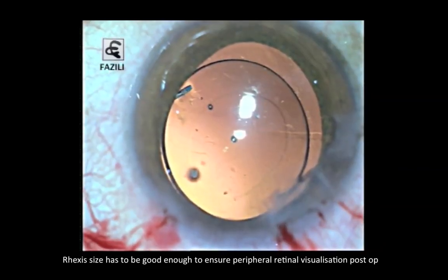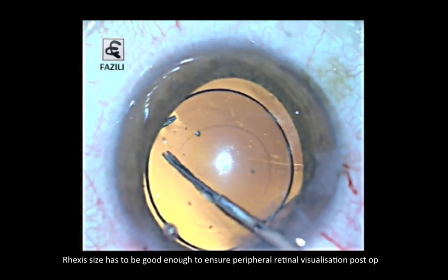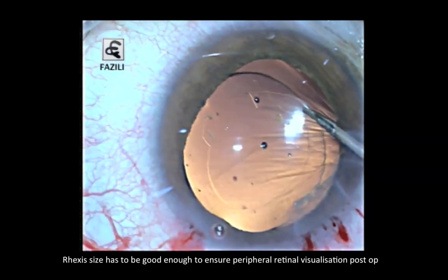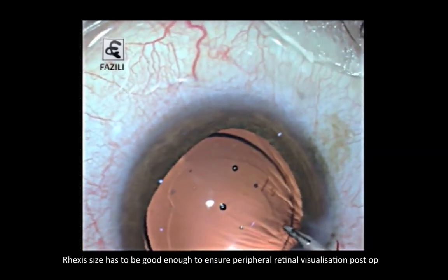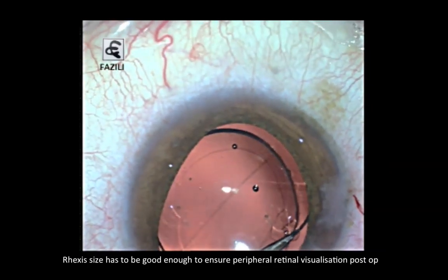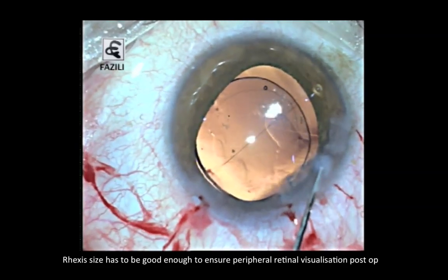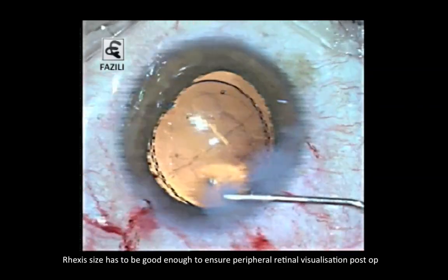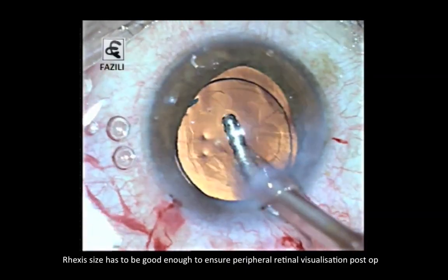You can see here, finally it's implanted, but I'm not really happy with the capsular rexis size, because a small amount of phimosis might lead to our peripheral retina visualization being very, very difficult. So it's always good to go in again and resize your rexis so that you have a good sized rexis. So surgery doesn't actually just mean finishing off a case nicely. It also means that you're looking at all the factors which are going to be there, or which we expect are going to give us difficulty in the immediate post-operative period or delayed post-operative time.